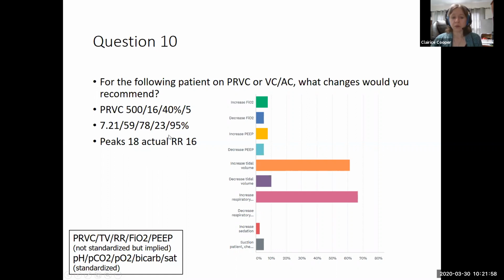So you could increase one, the other, or both, keeping in mind that the increase in respiratory rate will perhaps be a little less predictable because you are increasing ventilation of the dead space as well, so it may not be a one-to-one increase in minute ventilation.